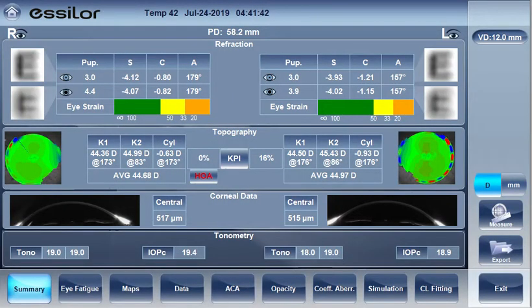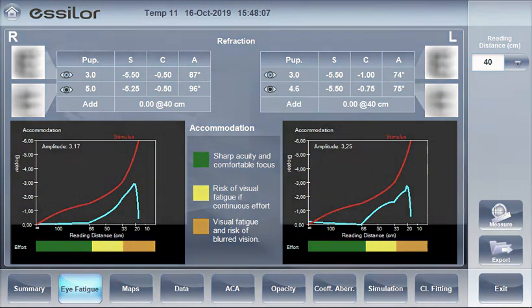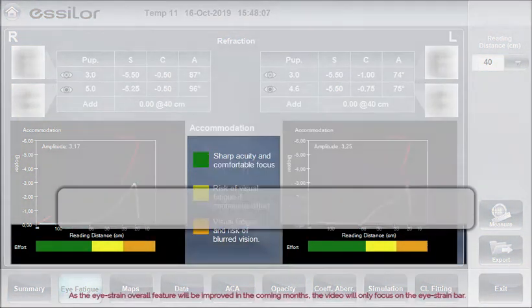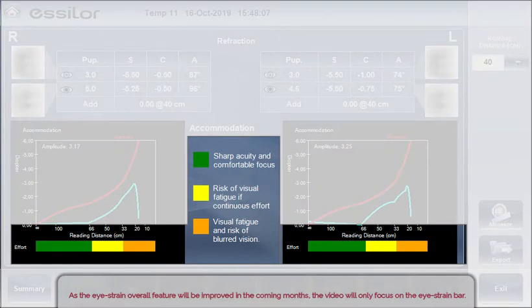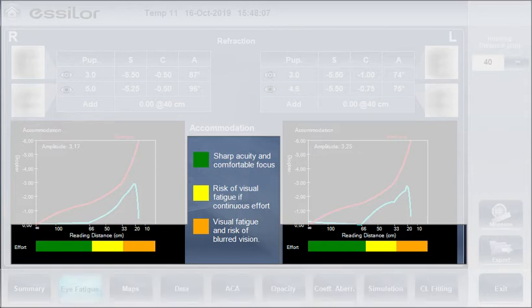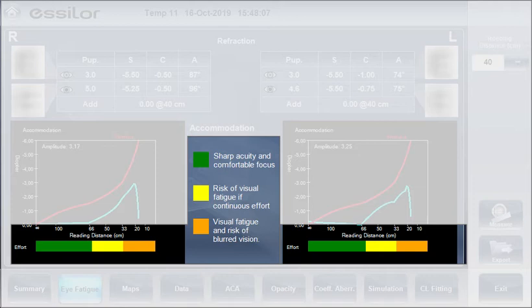At the end of the process, the results are immediately displayed. The bar represents the visual effort provided by the patient during the test, from far to near vision. We notice three different zones: in green, sharp acuity and comfortable focus; in yellow, risk of visual fatigue if continuous effort; in orange, visual fatigue and risk of blurred vision.